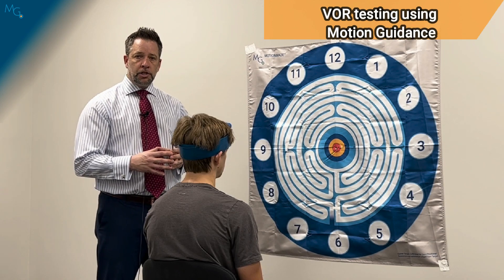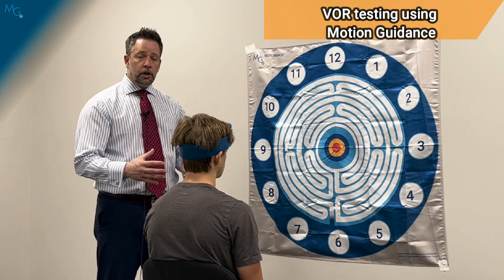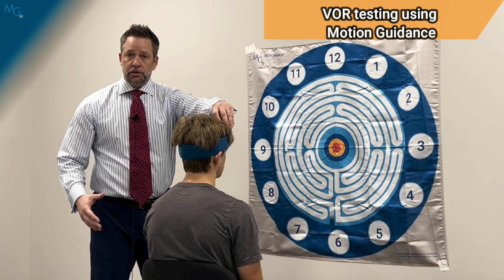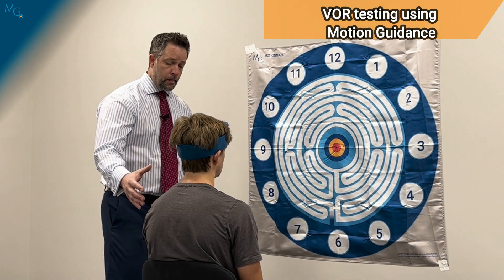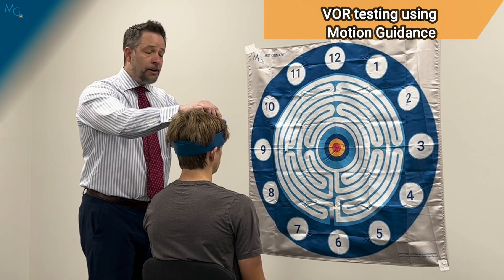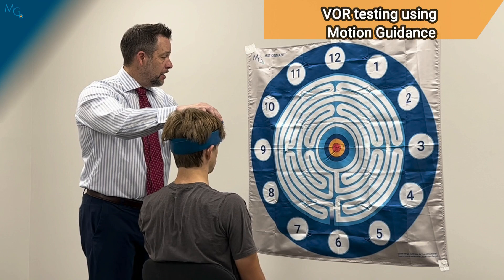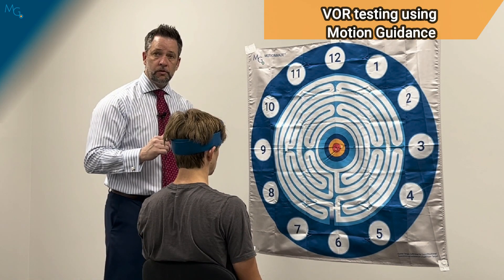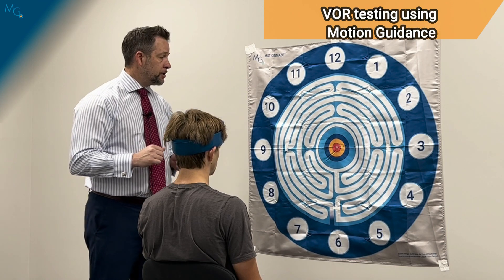To perform the VOMS with the motion guidance system, we're going to go through our calibration: have the patient sit upright with the laser off, have them look directly at the center target, hold on to the mount, turn the laser on, and put the laser into the center of the target. That's your starting position.